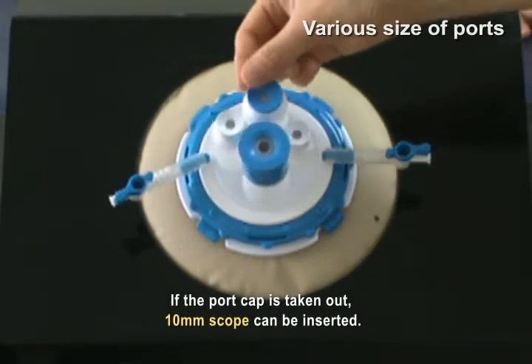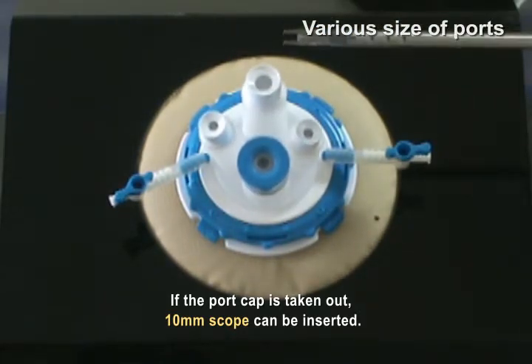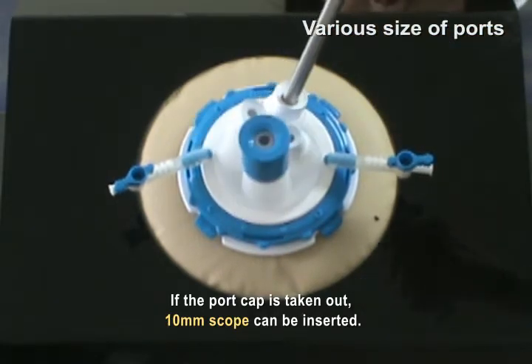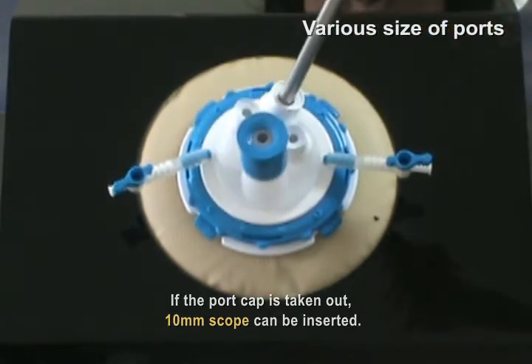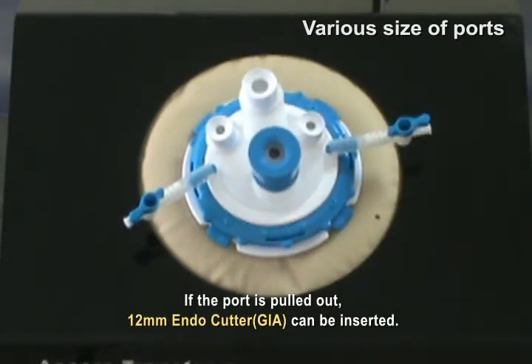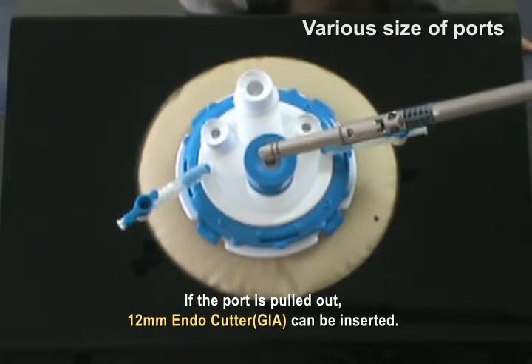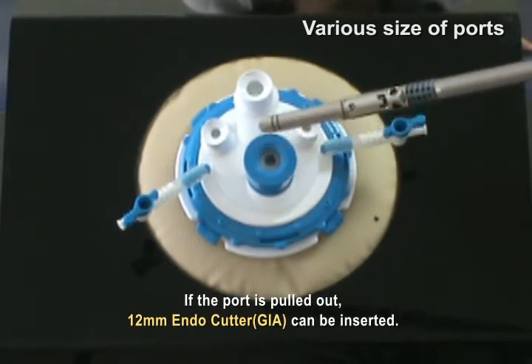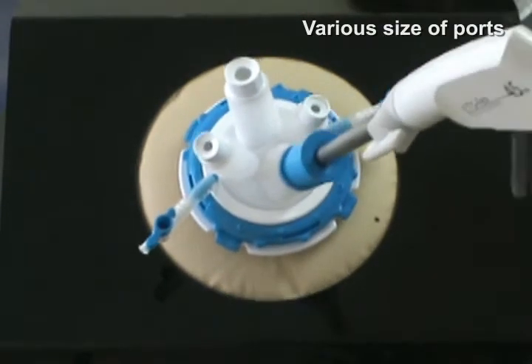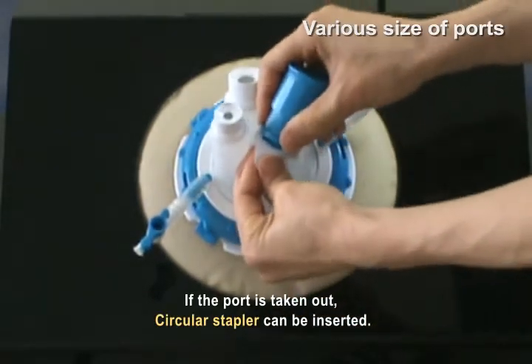You take out the blue cap to insert a 10mm scope. If you pull out the big blue port, you can insert a 12mm endocutter. If you separate the blue port from the silicone, you can insert the circular stapler.